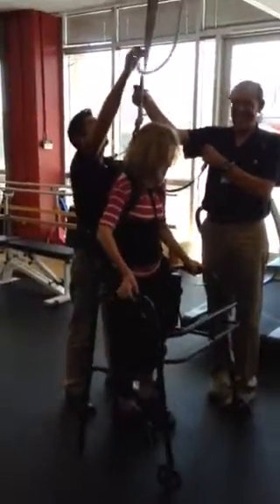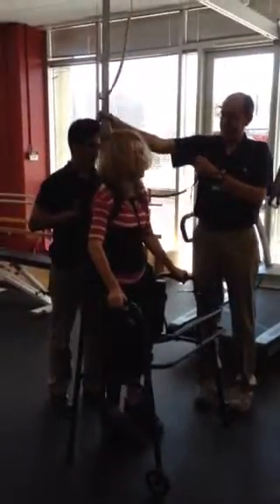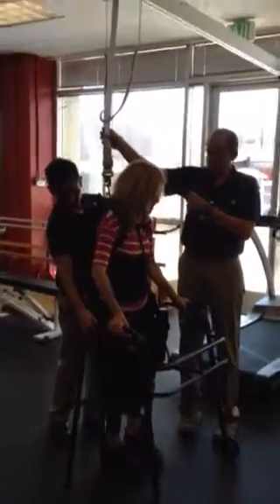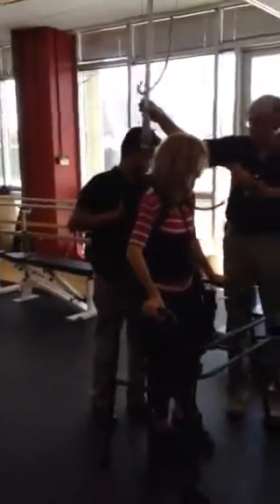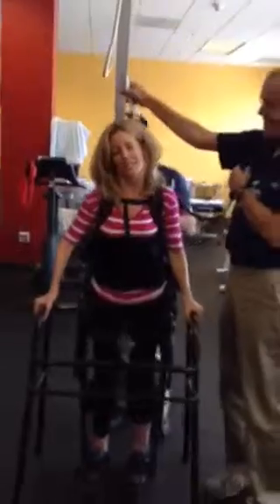I'll just let everyone drag down for you. It's okay. Take a break. How did it feel? I know you were scared — scary. But you did it. And you didn't fall. And his tethers got you. There's no way to fall. Thanks. That's enough — don't do it anymore.